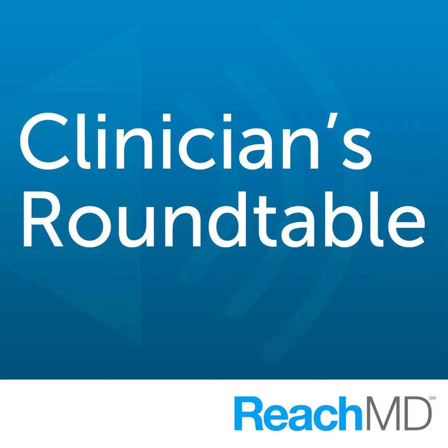Well, how accurate is the model compared to the actual patient? It's the patient's real anatomy, so it's very true to form. It's very much one-to-one to the patient's real anatomy. And again, as we learn more about this technique, I suspect there are going to be many more applications using robotics, where we can actually do a patient's anatomy based on a virtual reality simulation in one city, where a robot then can, by satellite, do the actual procedure on that distant patient in another city.